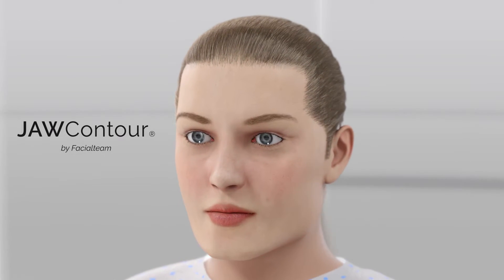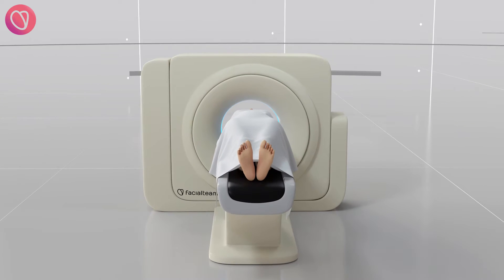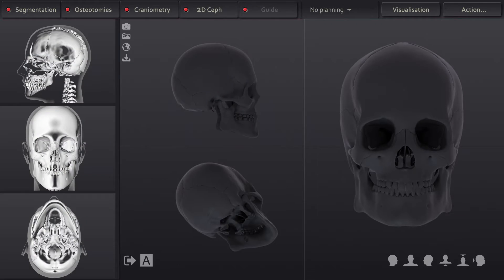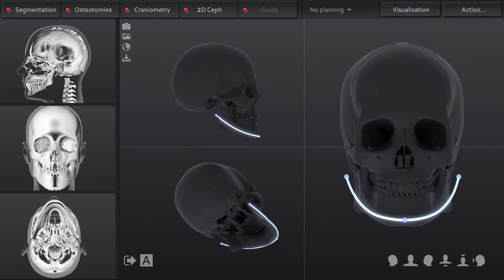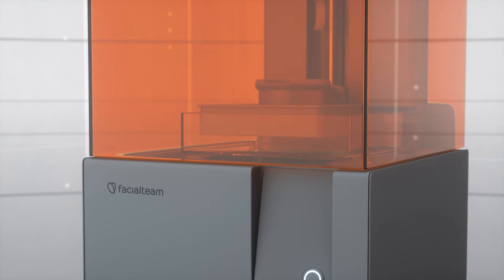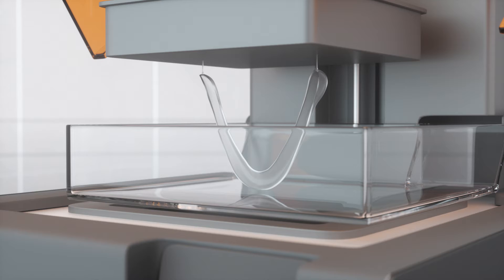Welcome to Jaw Contour by Facial Team. The patient has a 3D CT scan that produces a detailed image of the facial structure. The image is uploaded to the software in which the surgeon designs the area to be recontoured. A 3D cutting guide is generated and printed for later use in surgery. This is the most reliable method to transfer the virtual planning to the real surgical intervention.